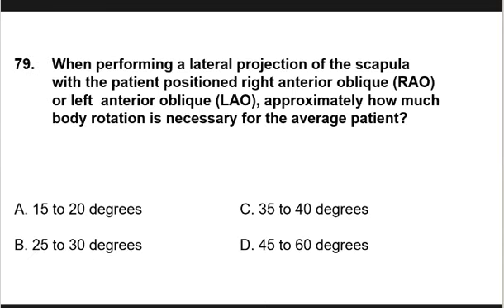Next number: when performing a lateral projection of the scapula, with the patient positioned RAO or LAO, approximately how much body rotation is necessary for the average patient?